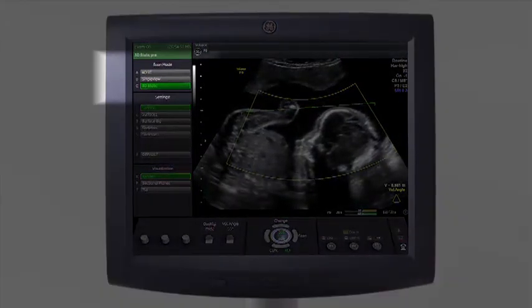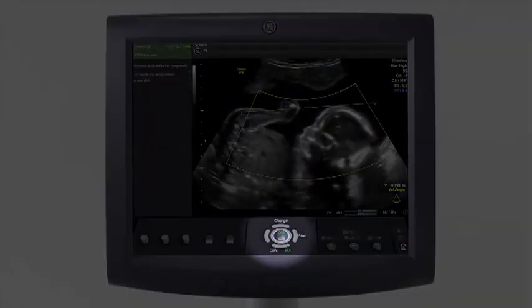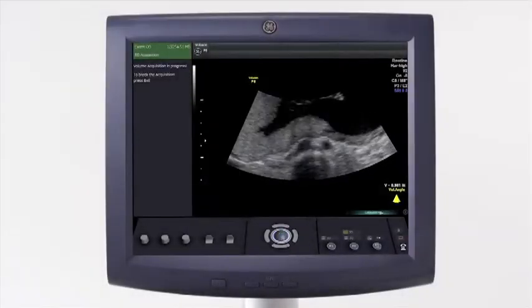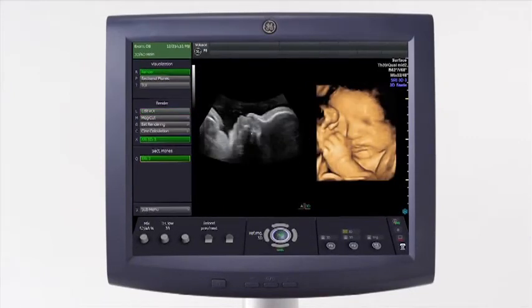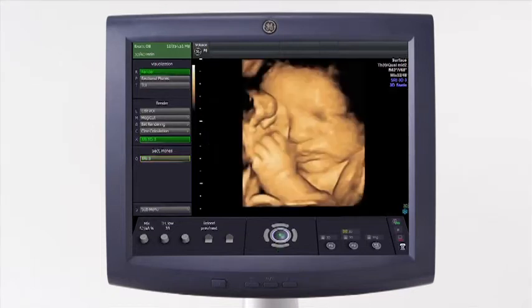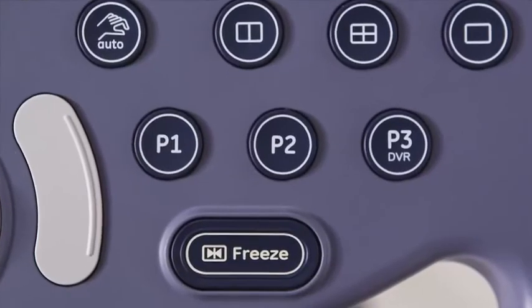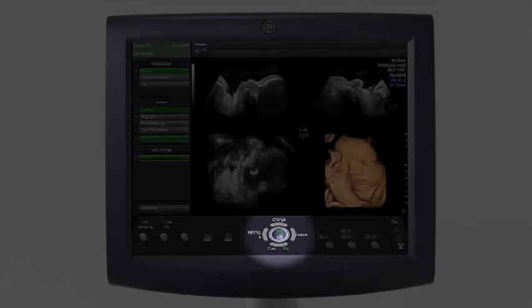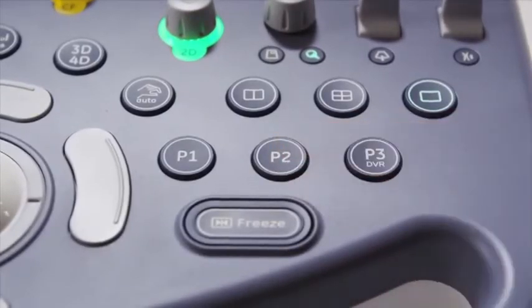Once these parameters are set, you are ready to acquire the volume, either static 3D or in a real-time 4D to help ensure clinical confidence. From the profile view, select the Start Trackball key. Once the acquisition is complete, the volume will be displayed depending on how the preset is set up. It could display in a dual display with both the rendered image and the acquisition plane, as just the rendered image, or in a quad display showing all of the orthogonal planes along with the rendered image. Selecting the Freeze key or Vol-Pre trackball key will cause the system to return to a live scanning state, so it's important to store the volume as soon as the acquisition is complete.